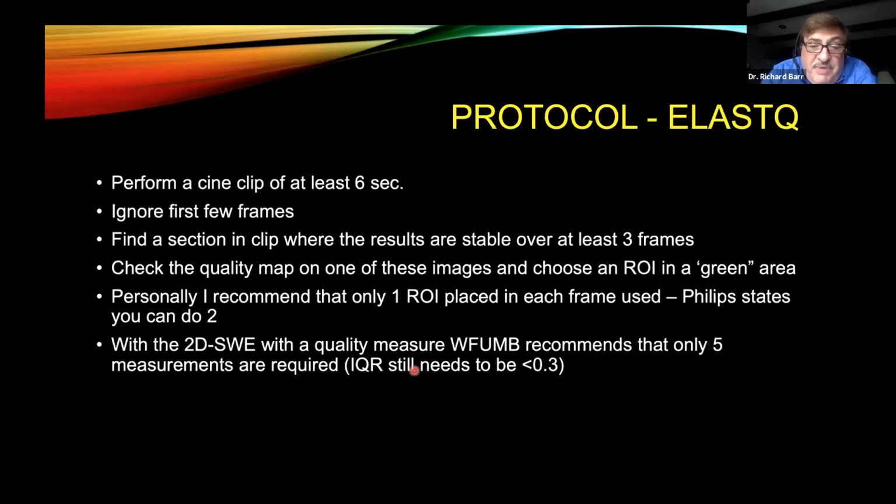If you have a difficult patient that's having a hard time breathing, you may want to extend that, or a pediatric patient, to 30 seconds, because we're going to be able to cine back and look to see where there's an area of no motion. In general, the first few frames will have some artifacts as we need the shear waves to build. So after you have your clip, you can now go through your clip and look to see where the velocity map is stable for at least 3 frames. So that's telling you that you've got very consistent data.